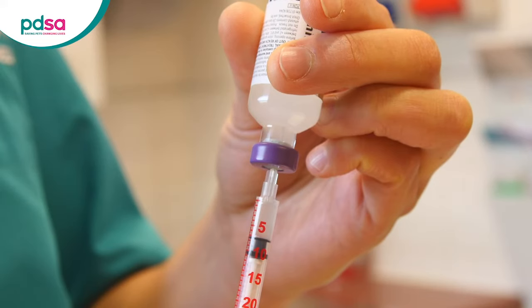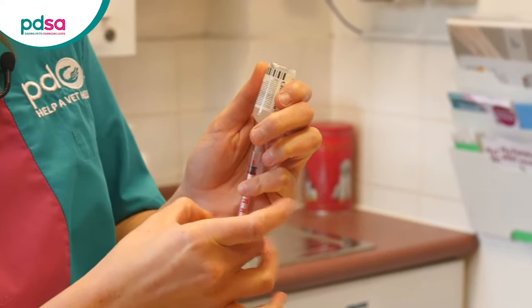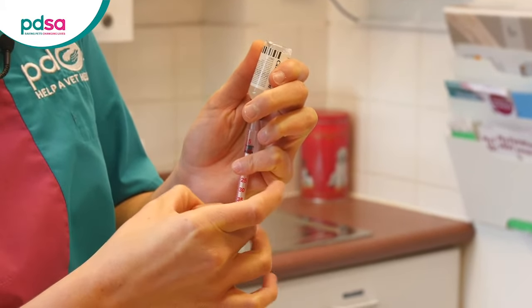Buster needs five units so we've drawn up seven. Leave the syringe in the bottle. Buster is on five units but remember every dog needs a different dose as prescribed by your vet. Tap the sides of the syringe carefully with your finger so that any bubbles go to the top near the needle.